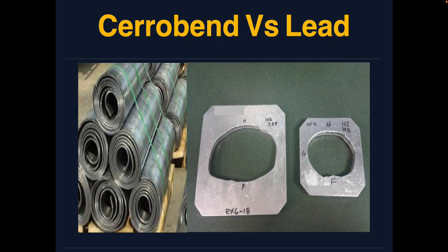I don't want my normal tissue to receive any dose. How much lead should I use? How thick should my lead be? The golden rule of thumb is nominal energy divided by 2. So if you have 16 MeV divided by 2, this will be 8 mm lead thickness you need.